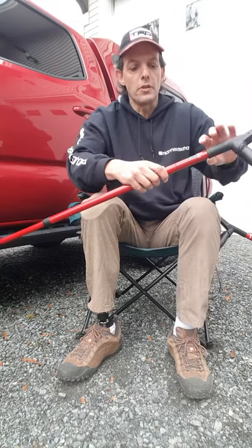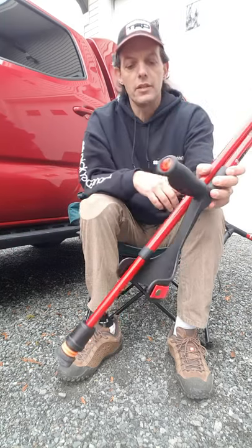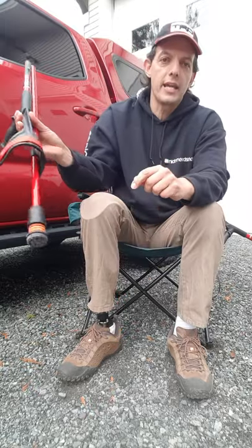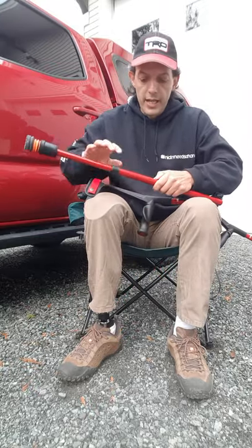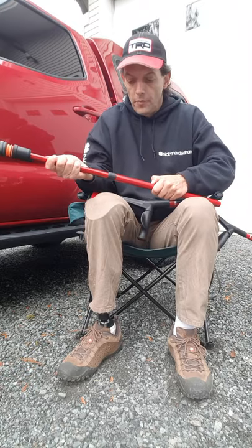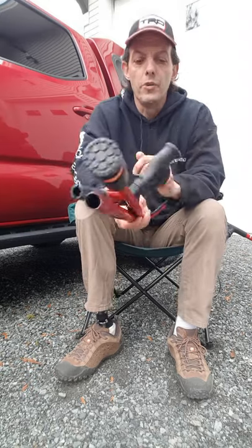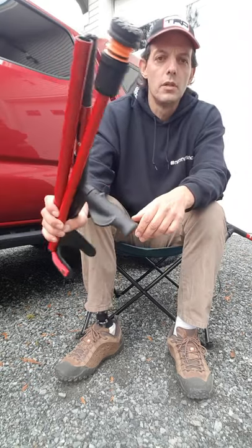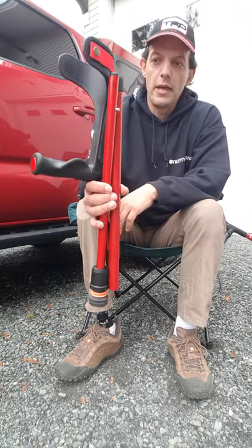They fold in two ways: you can take the top and fold them down, which makes them easy to store behind the cab of my pickup truck. Or, if you want to bring them along on a hike, you can undo the bottom collar and fold the crutches into three. They come with a security strap to hold them in this folded position.